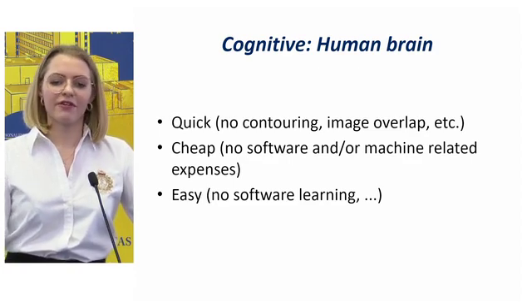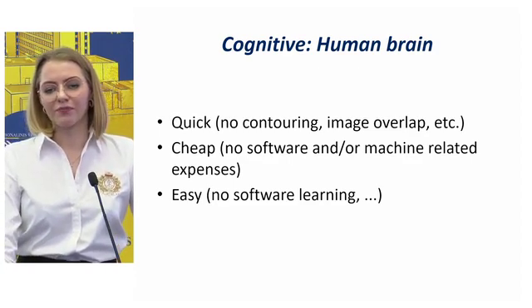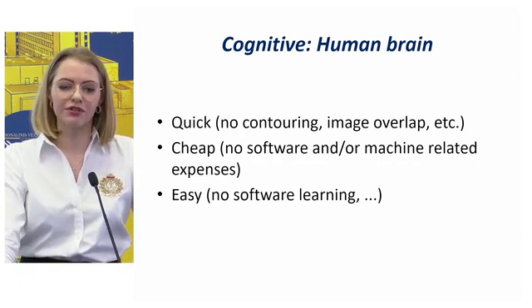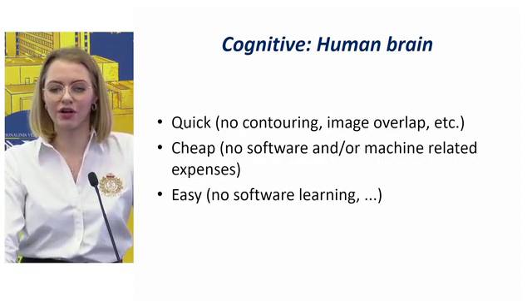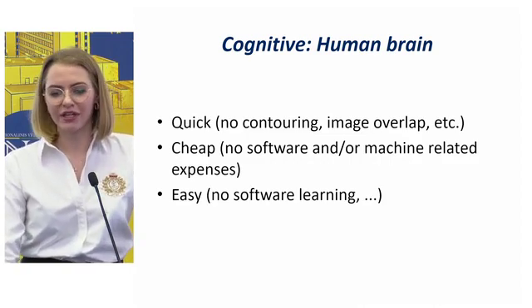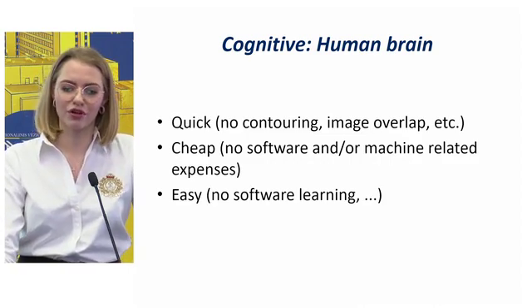So what is the benefit of cognitive prostate biopsies? It is quick, it is cheap, and it is easy. We don't need any contouring or image overlapping, we don't need the software or machine-related expenses, and there is no software learning.